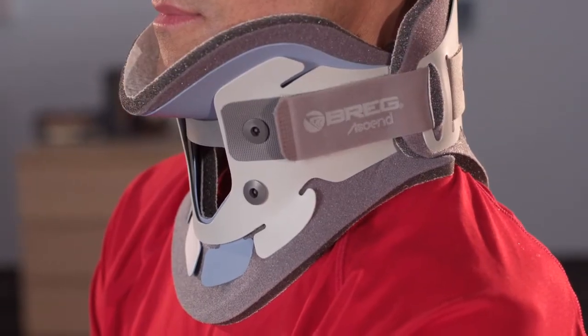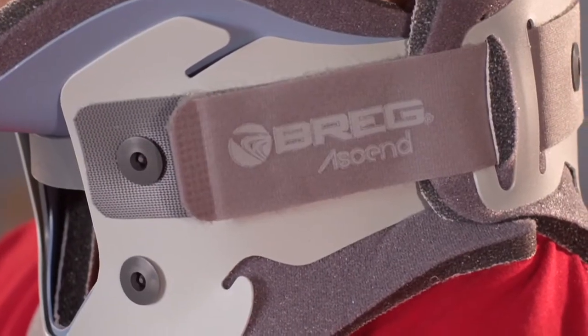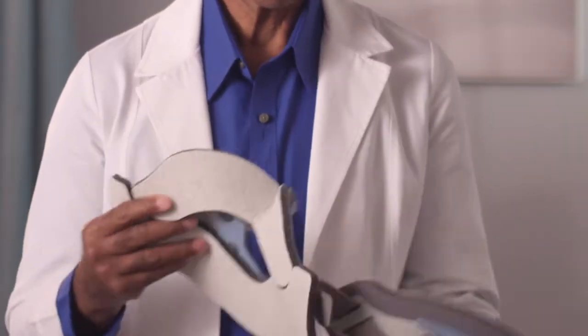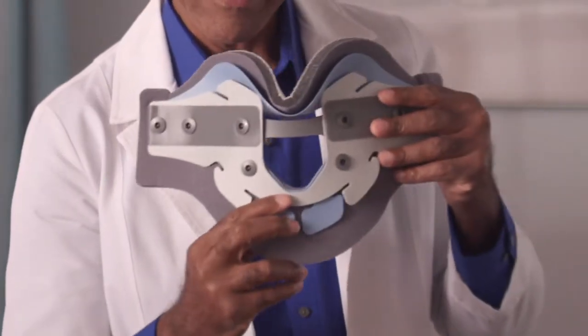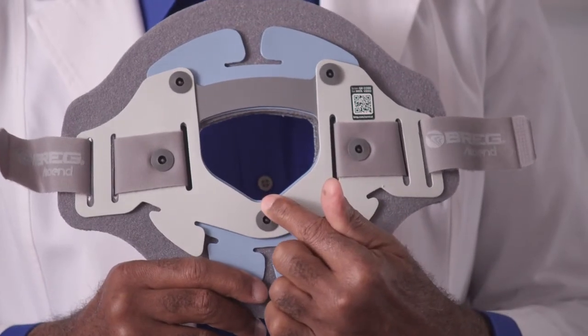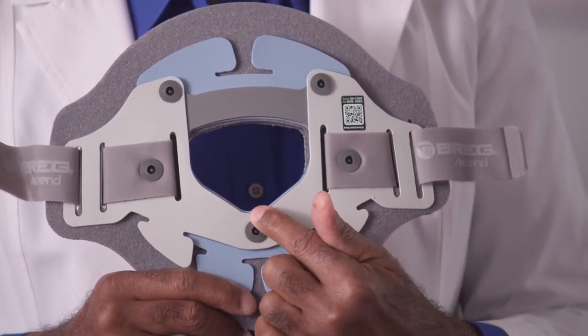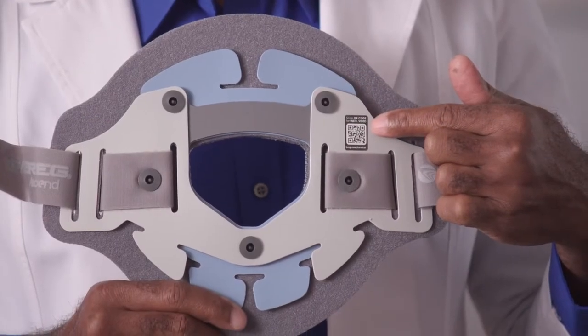The Ascend 172 collar comes out of the packaging with the back panel applied to the front collar using the hook and loop straps. Detach the straps and separate the two halves of the collar. As you are fitting the collar, ensure that the peak of the tracheal opening is pointing down. Similarly, on the back plate, ensure that the peak of the opening is pointing downward. You can also tell correct orientation by looking at the QR code label and identifying that the words are properly oriented when applied.